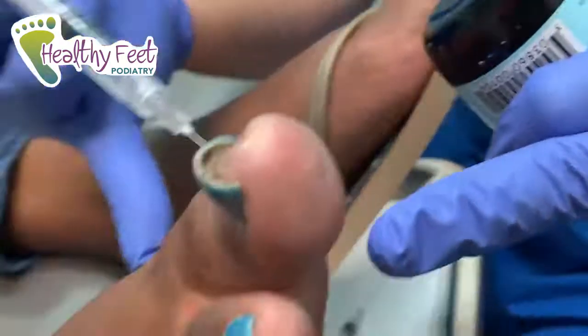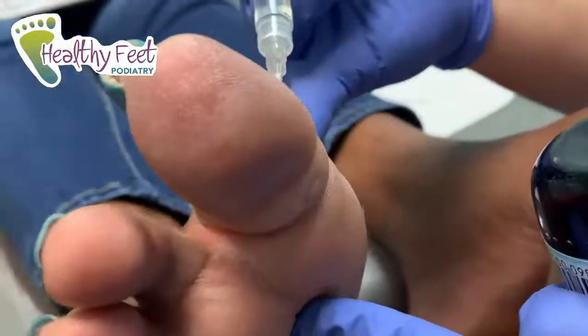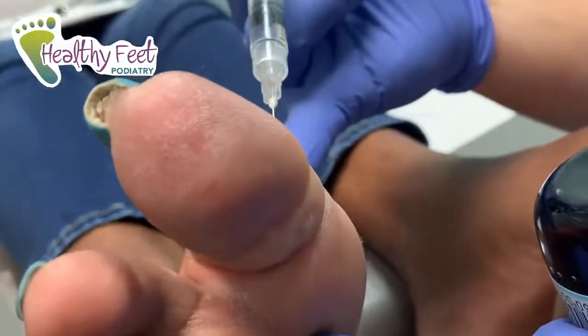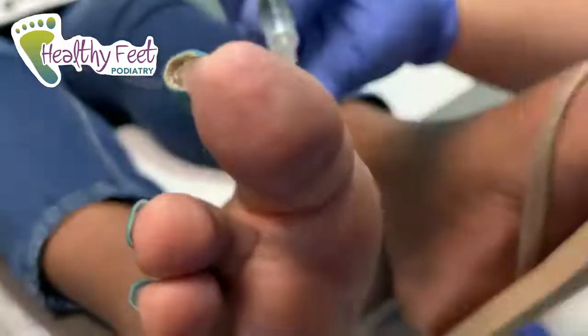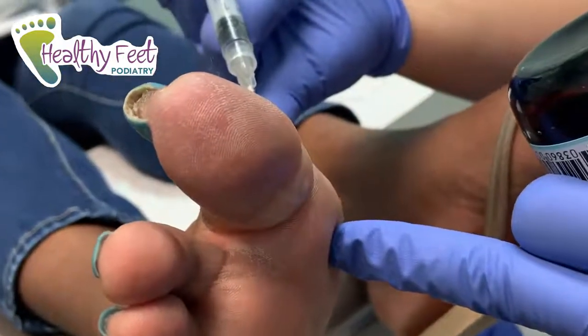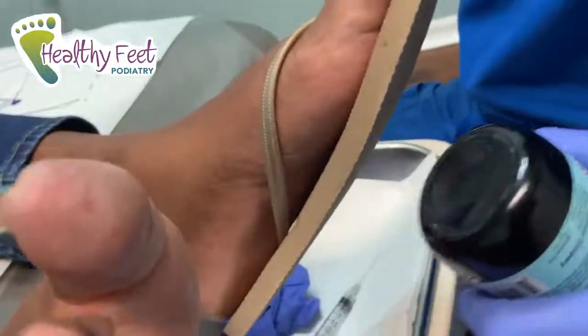You can kind of see the medication infiltrating, see that area blanching? Turning white, that means the medicine is infiltrating the skin right there. Okay, so we're creating a ring block, so that's what it's called, a ring block, okay? So, all right, let's let that marinate. We'll get started in a little bit.